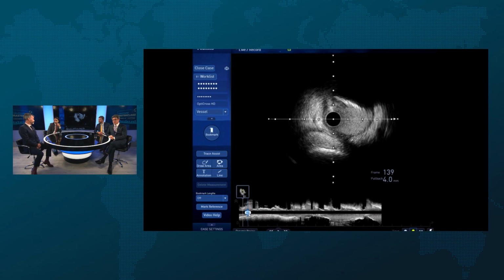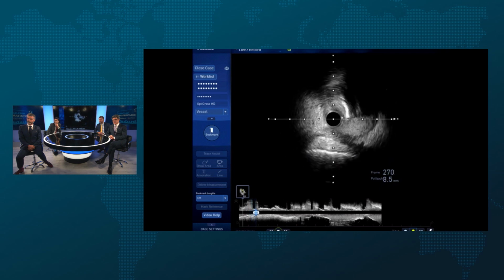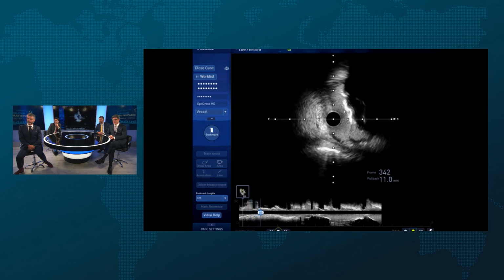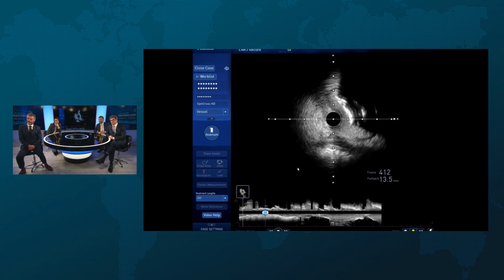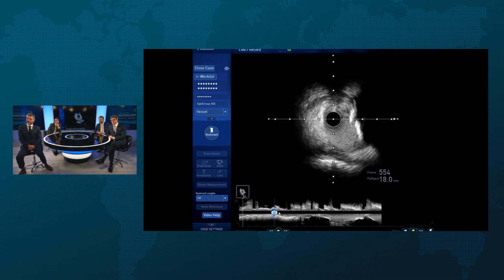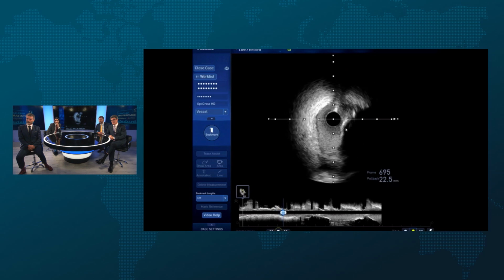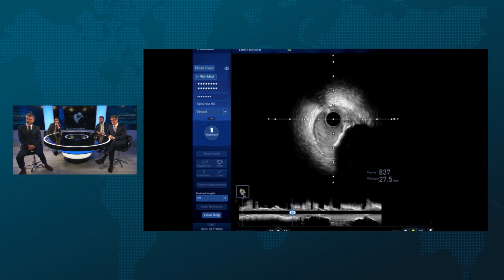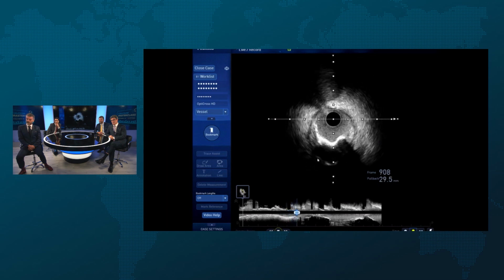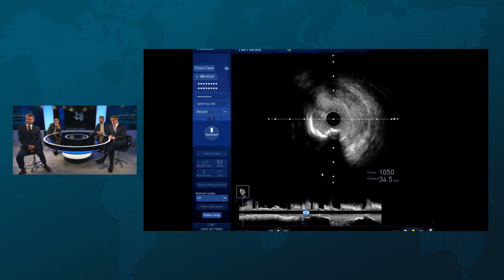And then as we come up through the distal vessel, you see that most distal nodule up here at 2 o'clock. Look at that. You just see fractured calcified nodules all the way through this vessel with kind of multi-morphology. Some of it's nodular and protruding, like here. Some of it's flat, thick, eccentric, and some of it's concentric. So the distal stuff's more nodular and eccentric, isn't it? And then as we come up proximally, it becomes more concentric.